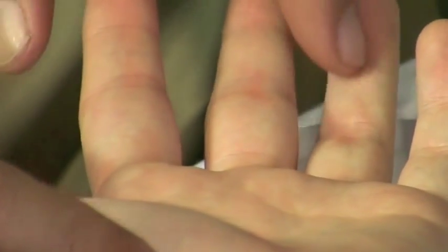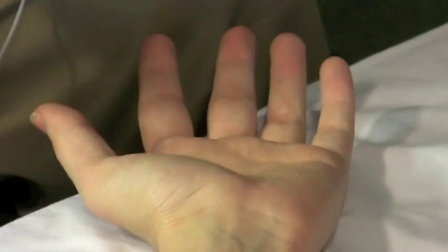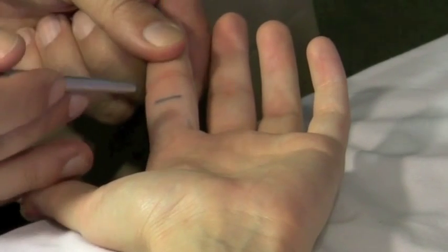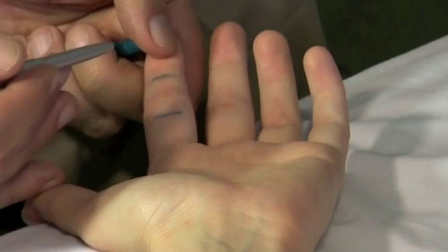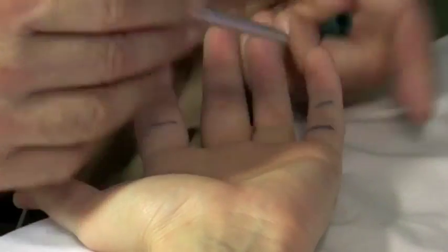So the median nerve, the first nerve that we study, innervates the thumb, index, middle finger, and part of the ring finger. And we usually study the index finger for the median nerve. To mark it, I will mark the place where I'm going to put the electrode. I put it here for the active electrode, the black. I put it here for the reference electrode, the red. For the ulnar, I put it here for the active, and here for the reference.